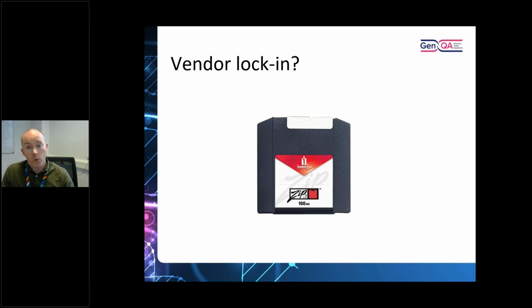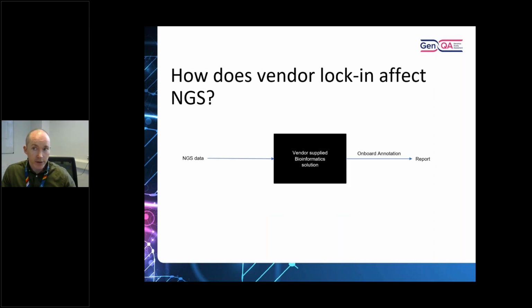And that can also happen with bioinformatics software solutions. So if we go to the next slide. If you have a pipeline that a vendor has provided for you that you've purchased, you can end up getting locked into that. It's the sort of black box approach that people frown upon, especially people who are into bioinformatics. You just don't really like that black box format, because everything is locked in. You can't see what's going on under the hood, and if you do look at it, it's not really covered. Solutions like this can be particularly useful if you don't have a lot of in-house bioinformatics support and you're getting set up.